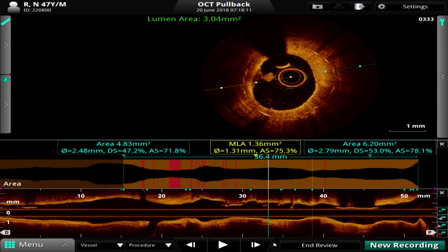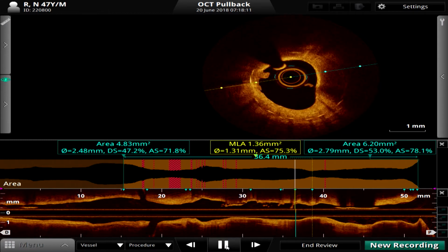Stent. Your thoughts? I think you need to put in another stent to treat this atherosclerosis, and the stent needs to be longer than the index stent to have complete lesion coverage both distally and proximally. Maybe you need to predilate to be sure that you can get adequate stent expansion. I would like to test the compliance of this tissue and avoid direct stenting. That's my impression. Absolutely, I would agree with him.